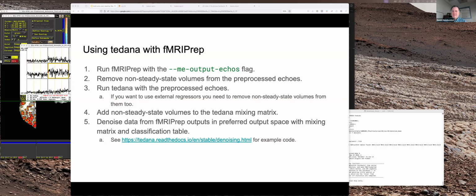In theory, if you run ICA and you find the ICA components that actually represent those 12 regressors, you might actually only have to remove 3 or 4 time series based on motion. So I think that's the goal, but how to actually do that and how to set our thresholds is still a work in progress. And I think the more people that try this and play with this, the better we'll be able to find best practices. But I think that's what I want my goal to be, but we don't have the best practices yet. And for global signal, I'll just say no, but ever. But that's a longer discussion.